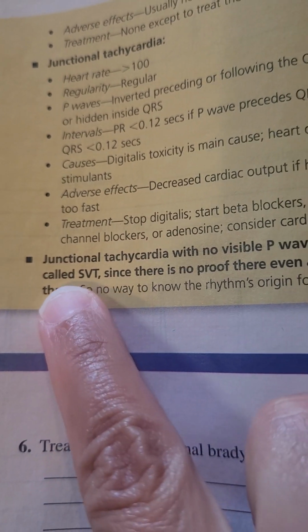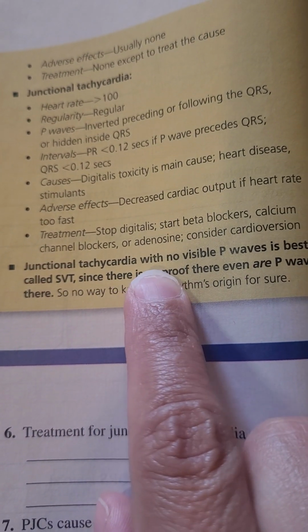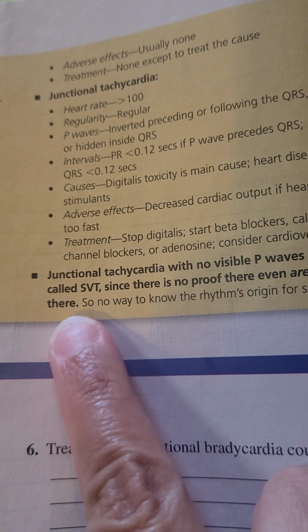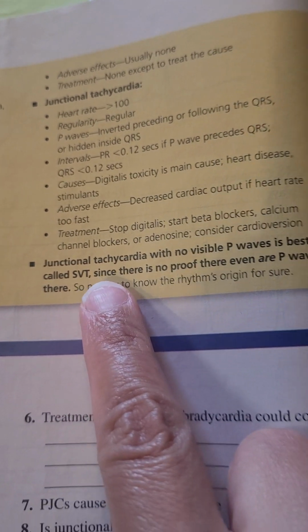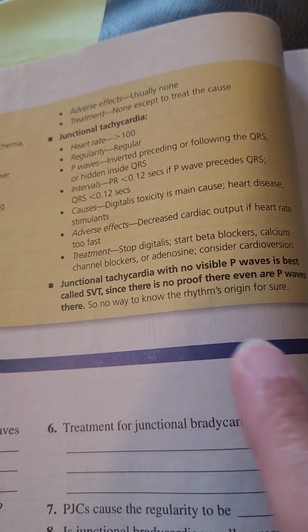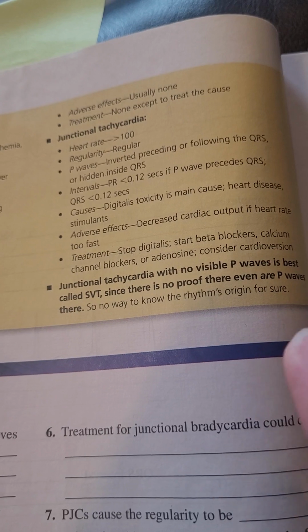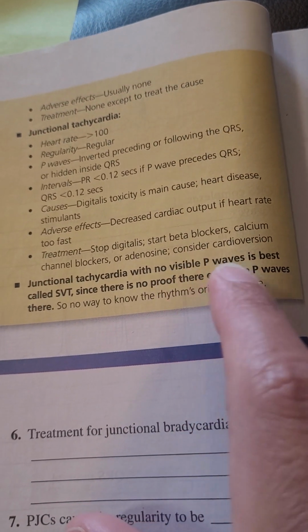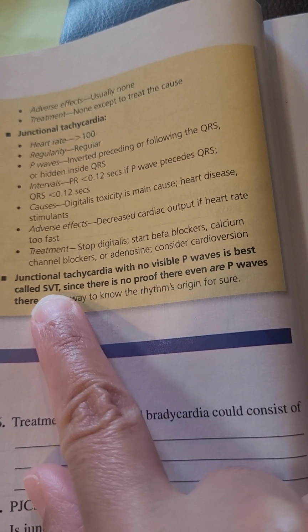See, this one tells you a little bit better. Junctional tachycardia with no P waves is best called SVT. If you see a rhythm that's running too fast, but you can't tell if it's junctional tachycardia or SVT, it says it's best to call it SVT.